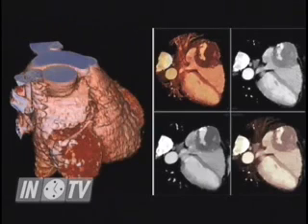But okay. It basically shows very nicely that not only can you see blockages, but you can see dilation of the blood vessels. An aneurysm happens when the blood vessel wall is weakened in an area, and then just like if you laid a garden hose in the sun and a portion of the garden hose bulged out, a portion of the artery bulges out. That can cause problems for patients, and it can mimic heart attack symptoms. So a fair amount of the time we will find an answer by getting the cardiac CTA that is not a blockage.